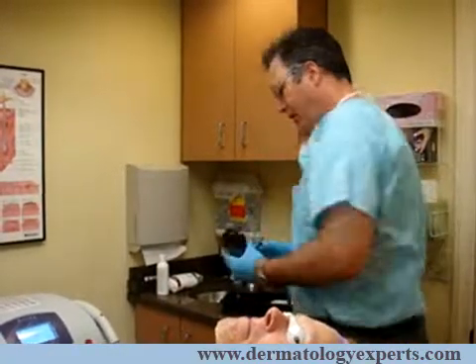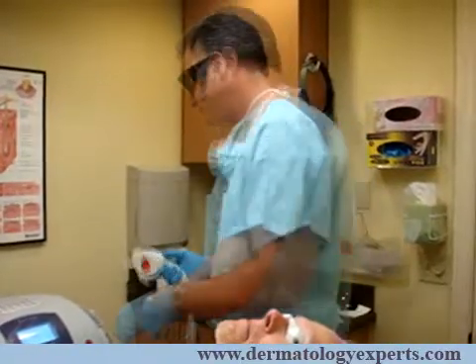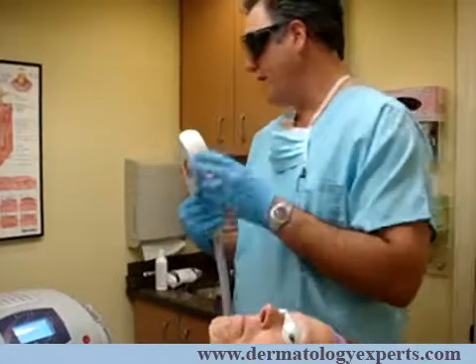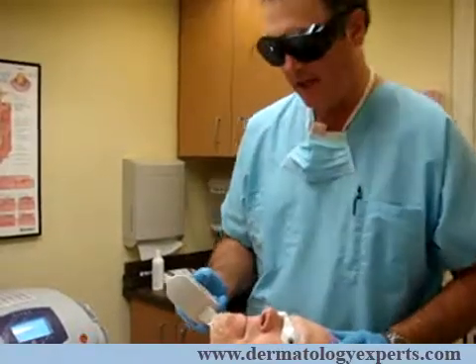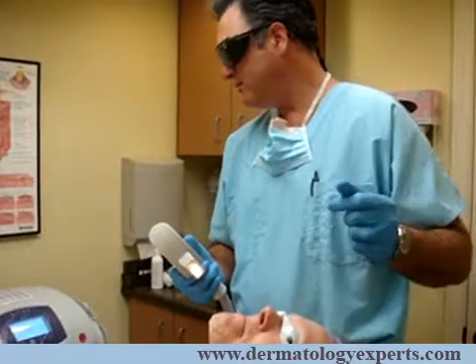We'll then go ahead and put on a pair of safety goggles here just to protect us from the bright light. This particular device has a wavelength of 650 nanometers, which is the perfect target for the hair bulb and hair removal. We'll gently place the device against the skin, using parameters of about 18 joules at about 30 milliseconds.